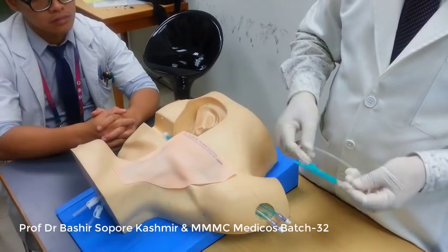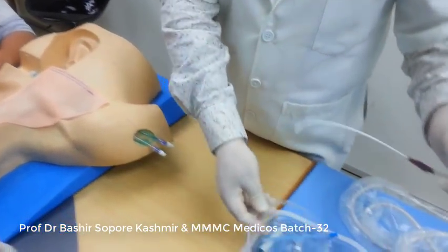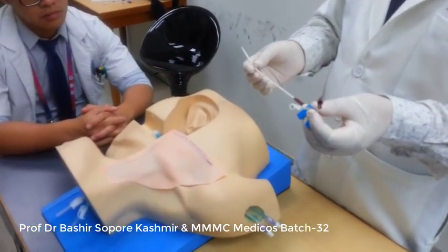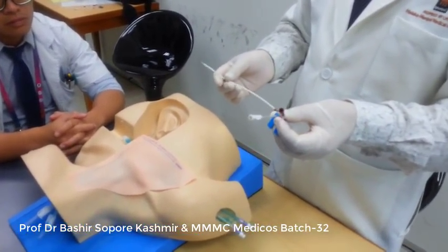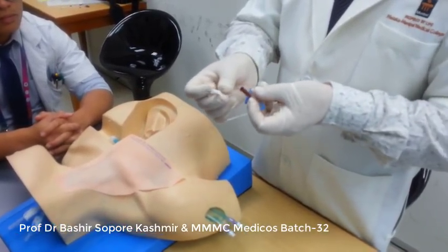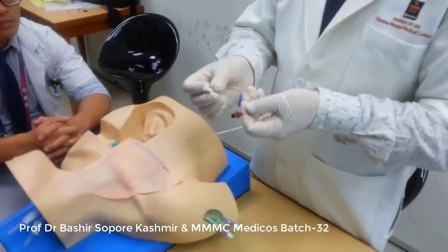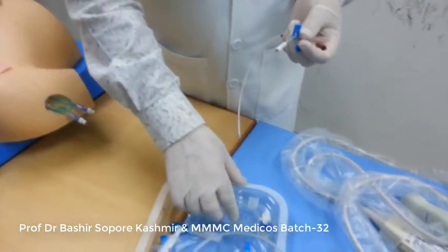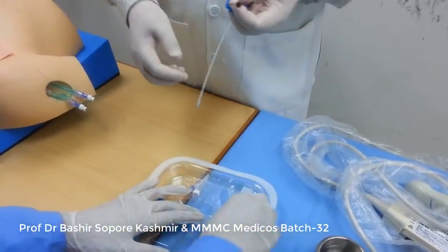So this was about the guide wire, and then we have this 2-lumen catheter. As I said, this is called a Seldinger catheter, or the technique is called the Seldinger technique. Now the ends are capped with knobs. So we have knobs also here. You can take the knobs here.